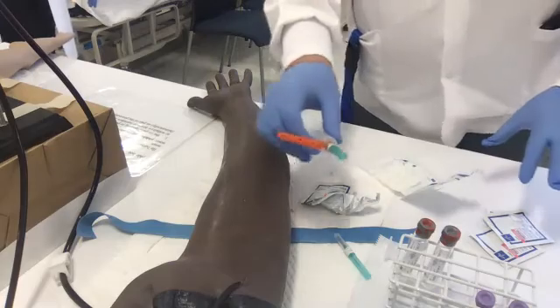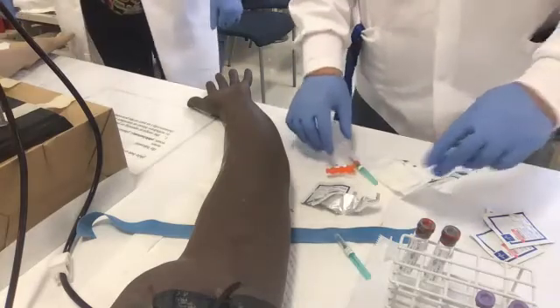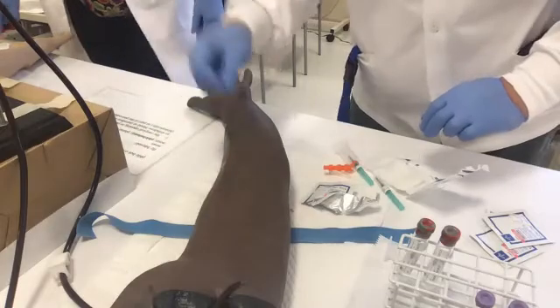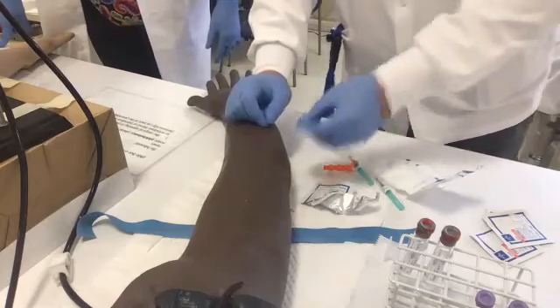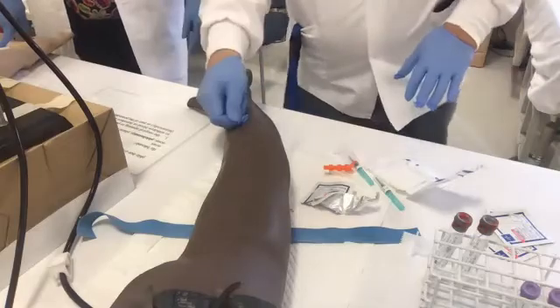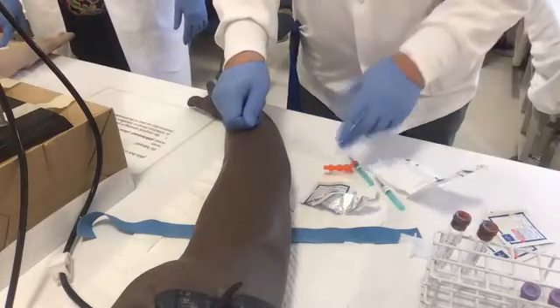So here's our equipment. Do you see this orange thing? That is our safety guide. I got everything all set up. I'm right-handed, so this will be my anchor or sticking hand, and my left hand will be the hand giving me equipment. If my patient stuck their hand out here, my right hand is the sticking hand, and the left hand will be the transfer hand. So that's when I can do multiple tubes. I can do everything here.